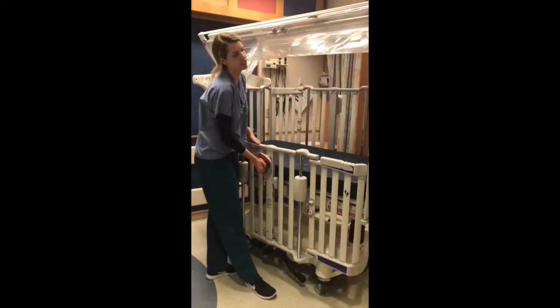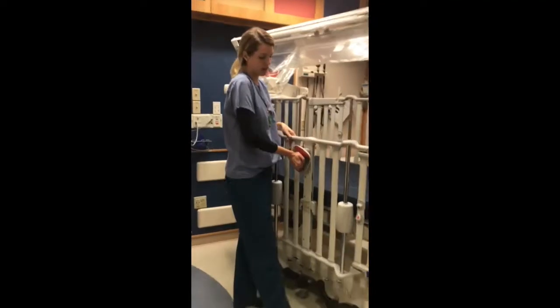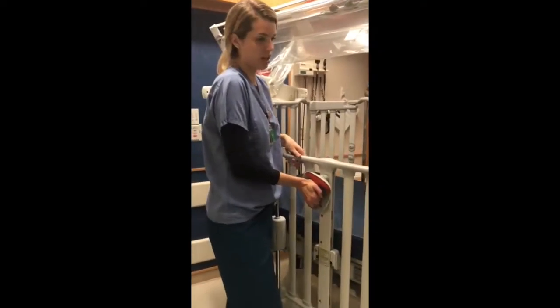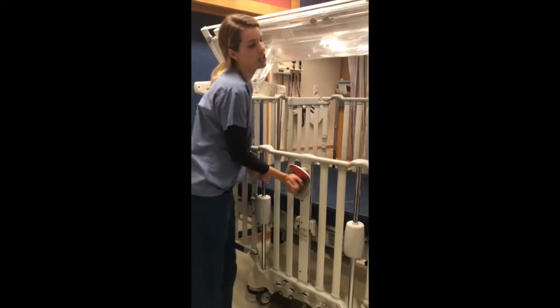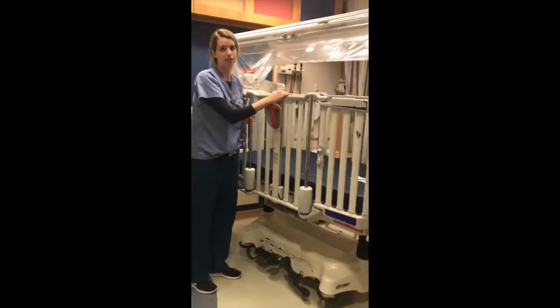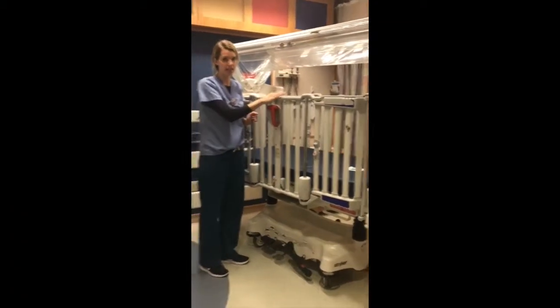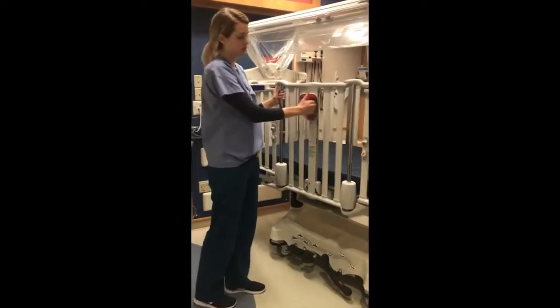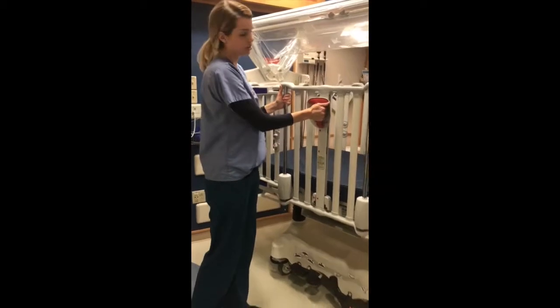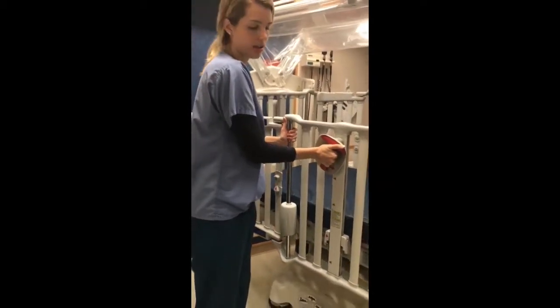This is one height. You'll squeeze the lever towards you and rotate to the left or right. Then there is a mid height in the locked position, and then of course the highest height, which we recommend if you are ever stepping away from the bedside. All four side rails should be at the highest height. To lower the side rail, operate it using the same method — squeeze the lever towards you, the red handle moves to the right or the left, and then you can slowly lower down.